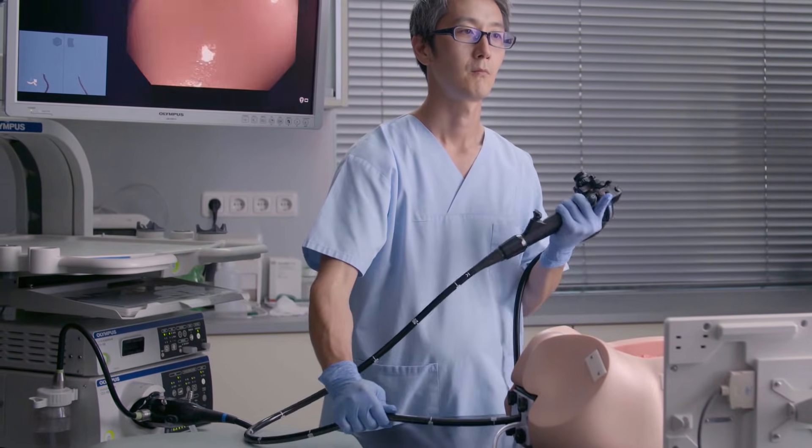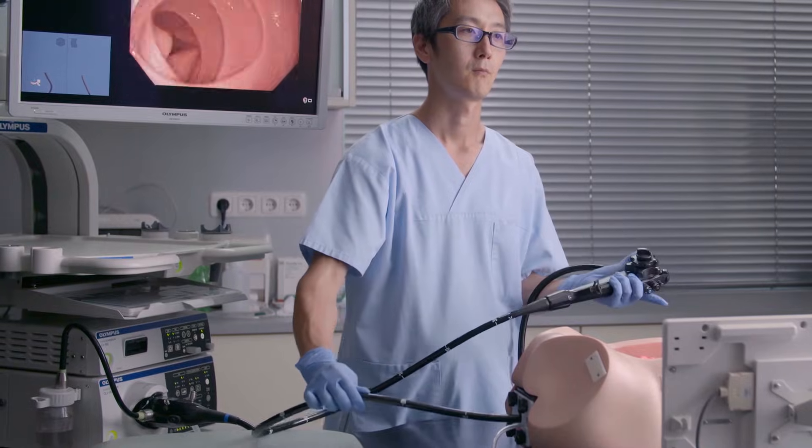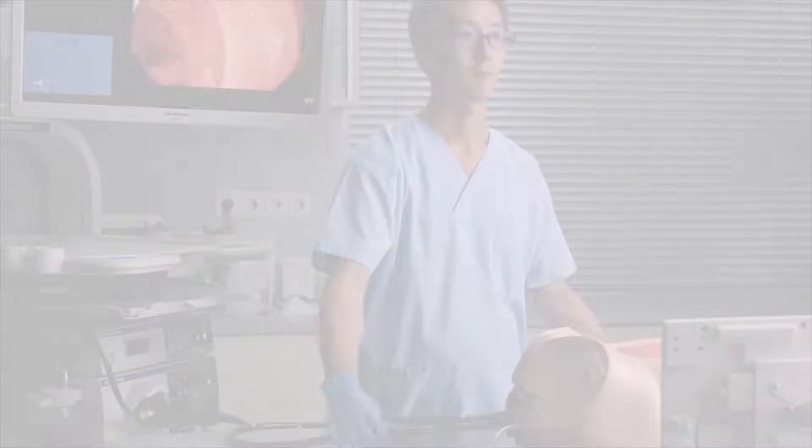By synchronizing both movements, you can torque the colonoscope even more efficiently. Let's repeat the exercise.